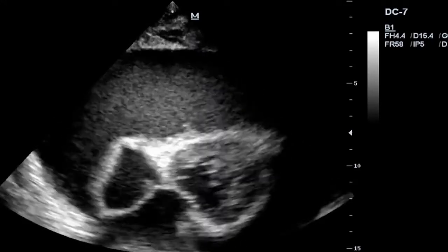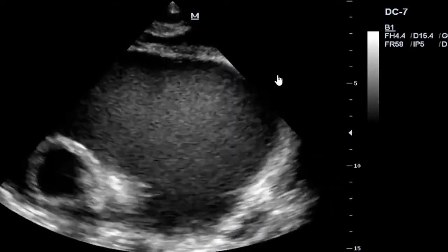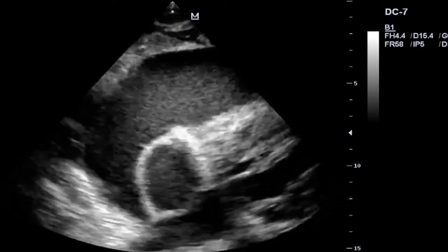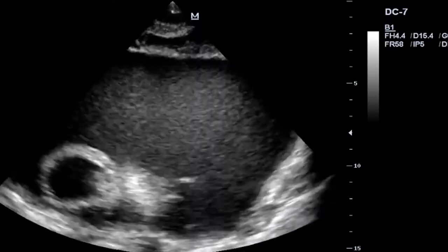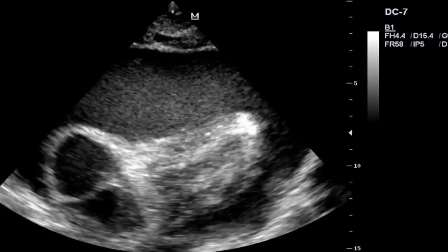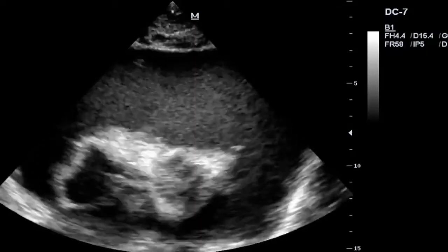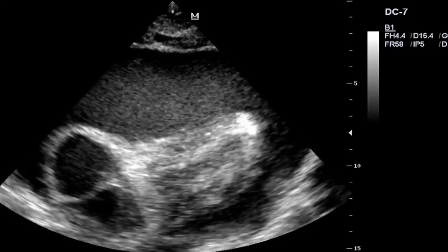So this is a classical case of what is called cardiac tamponade. This is the free fluid, a lot of this free fluid here that is actually compressing our heart. So in a nutshell, this is it. This is what we call pericardial effusion, leading to a condition that we don't like, that is called cardiac tamponade. The heart is now troubled, it's under compression, it's under tension.